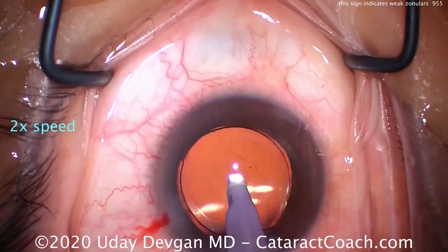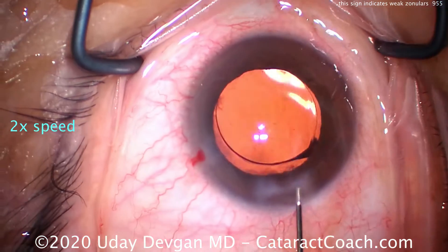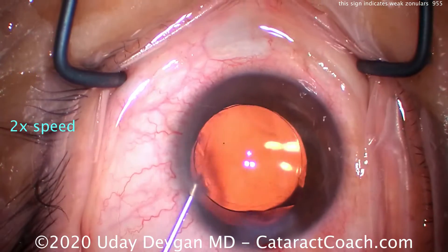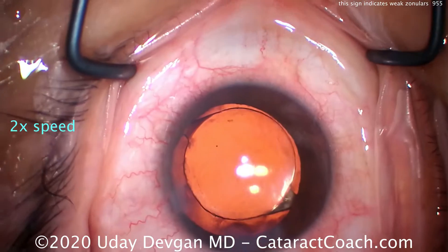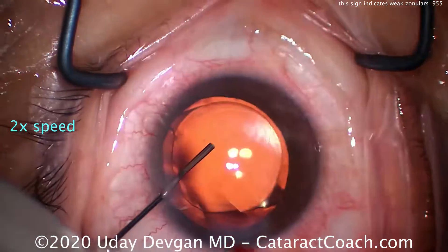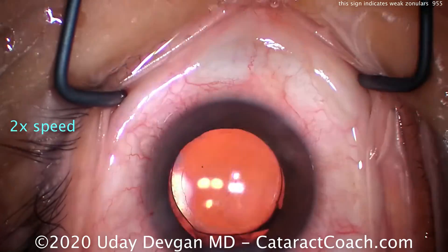I want to emphasize that subtle sign: you filled the anterior chamber with viscoelastic completely, so at the beginning of the case the AC volume was exactly the same as the volume of viscoelastic placed. But then as we started the capsular rhexis, we noticed the nucleus deepened — the AC deepened, nucleus went backwards — and that allowed the AC volume to increase, getting filled in by aqueous that was hidden underneath the iris. That's the edge of the aqueous-to-viscoelastic interface you can see so clearly — that's our subtle sign.